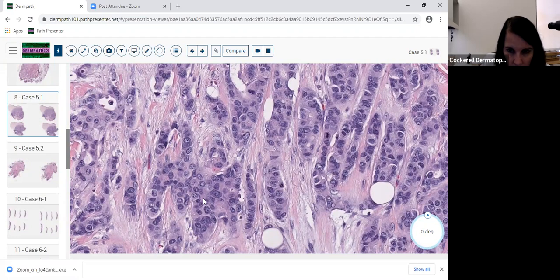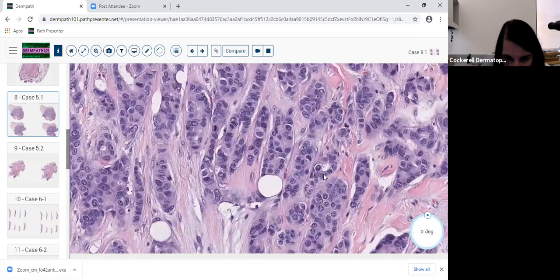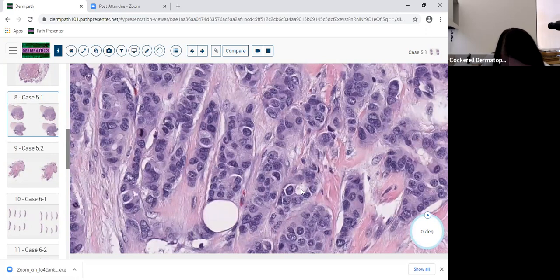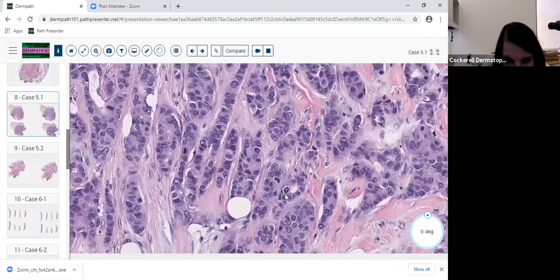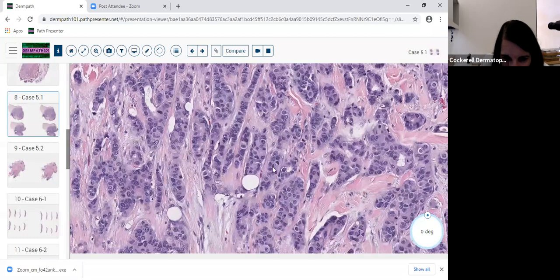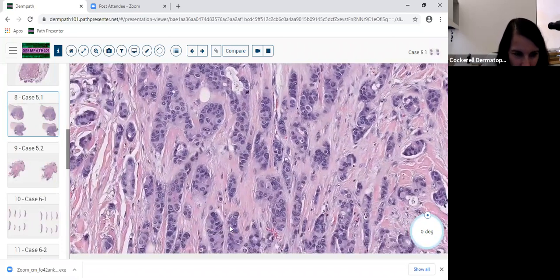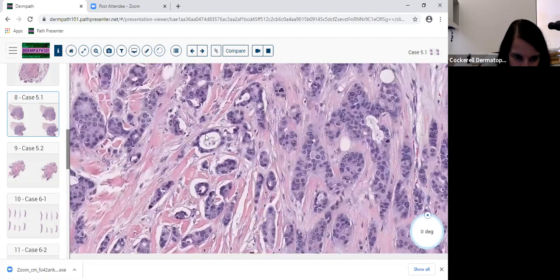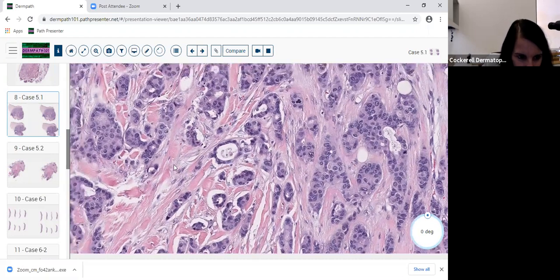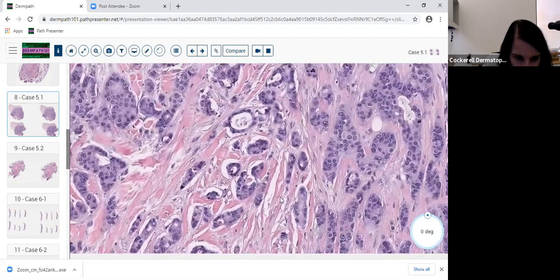You're seeing glandular lumina. So here's another gland. You start seeing that. And look, you can see that this is a true lumen. It's not just a cystic space like here. That's a true lumen. So you have to be able to differentiate true lumen from just those cystic areas or just fat, you know, in between. So here's a nice gland here. I mean, I think this fits pretty well for a gland. Right here, dead center. Here's a beautiful gland that's in dead center.